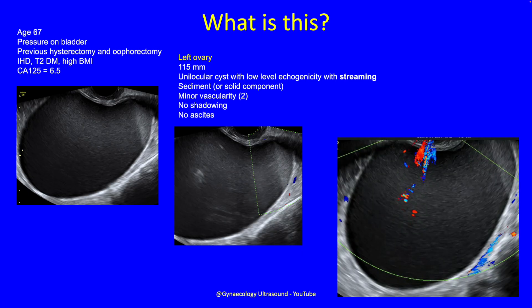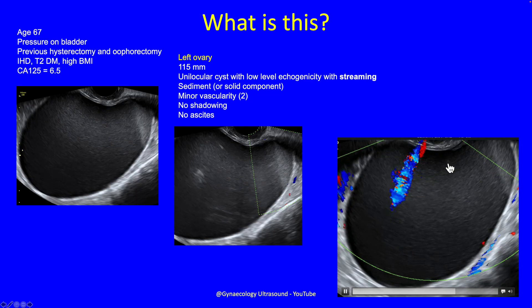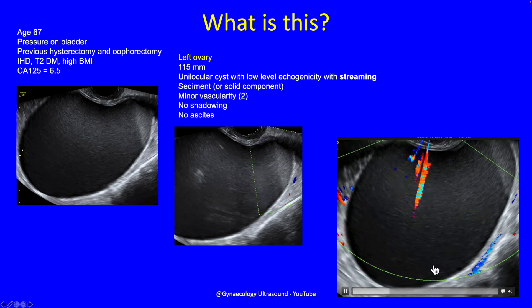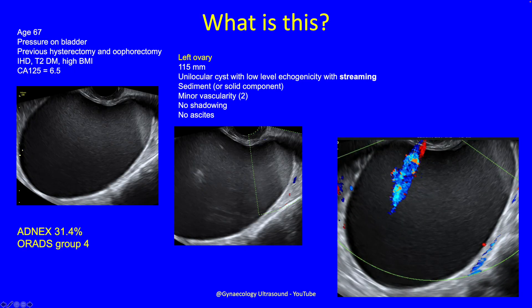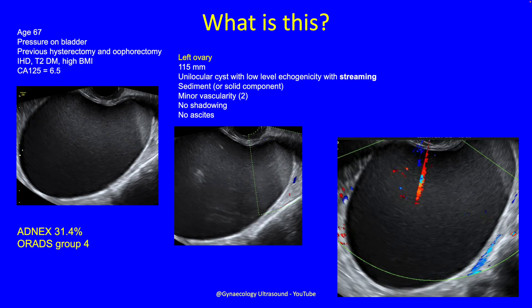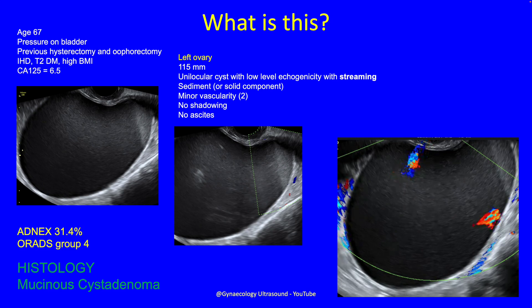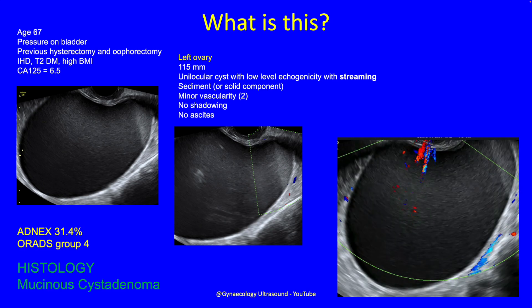Streaming is where you hold your probe still, put color Doppler on, and the energy of the color Doppler makes particles drift — you see that with blood and mucin. When we calculated ADNEX, this cyst came out as a risk of malignancy of 31%, and in the ORADS system this is a group 4 lesion. The histology was a mucinous cyst adenoma.